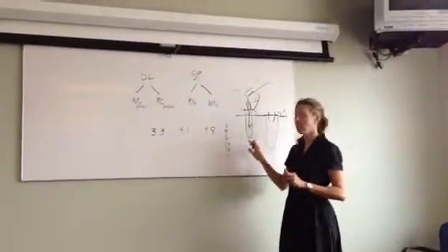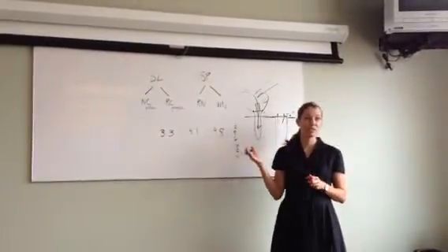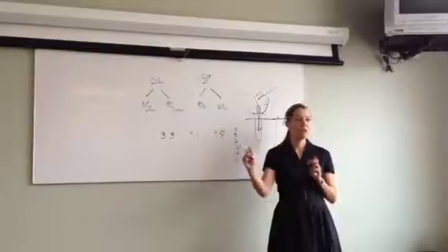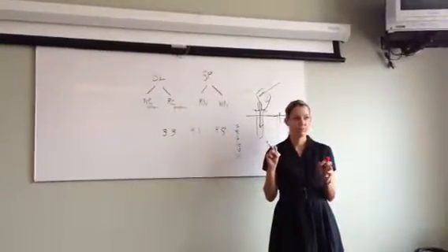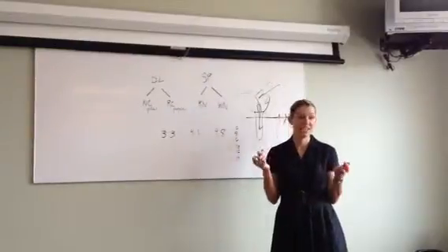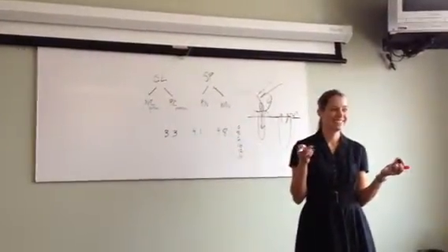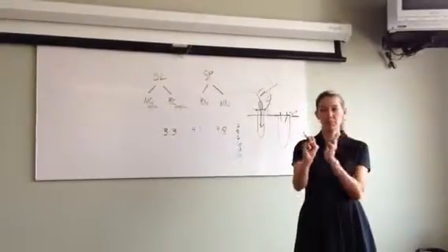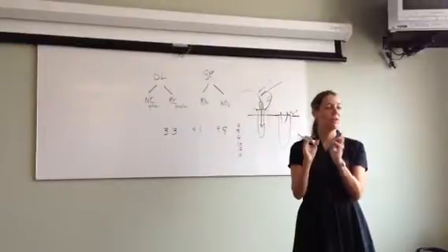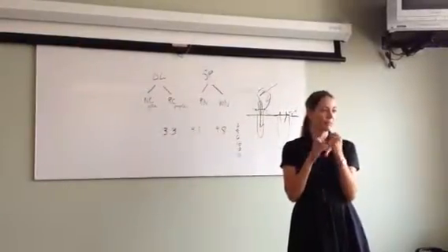So all of our implants have a conical connection, or a Morse taper connection, and when you torque it, what happens? Because today is all torquing, all abutments. Yes, it kind of cold welds. The sides of that taper, when you torque it to 35, will cold weld together.